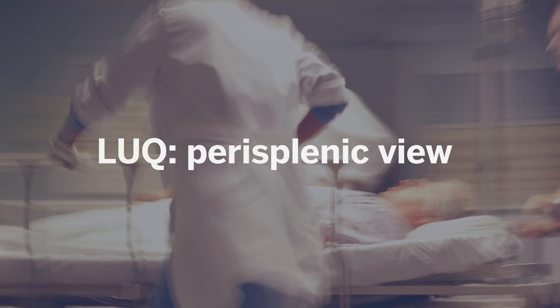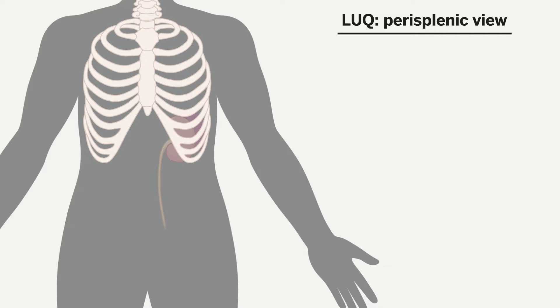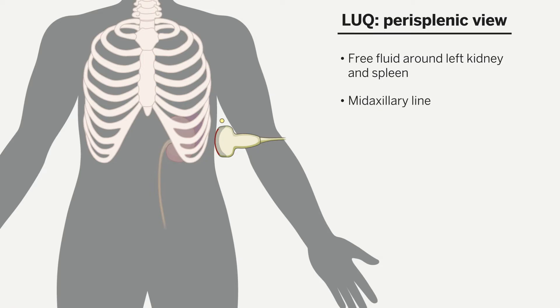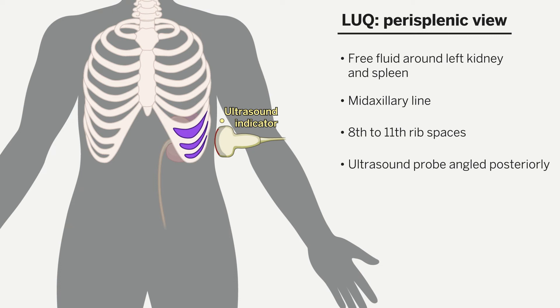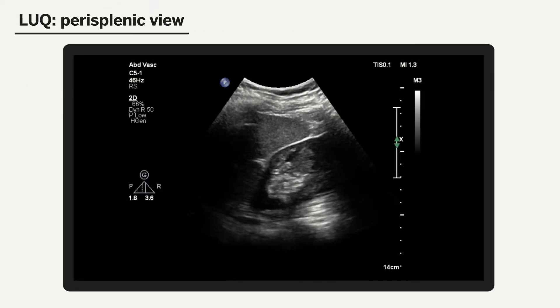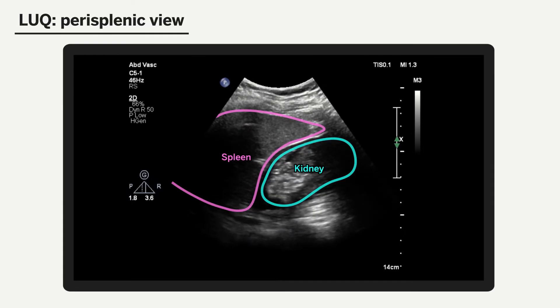Moving on to the left upper quadrant, or perisplenic view, this view is used to assess for free fluid around the left kidney and spleen. To obtain this view, we place the probe in the mid-axillary line on the left side between the 8th to 11th intercostal space, with the indicator again facing towards the 12 o'clock position or the patient's head. As anatomically the spleen is a very posterior structure, the probe will also need to be in a very posterior position in order to obtain this view. Sliding between intercostal spaces may be required to optimize this view.